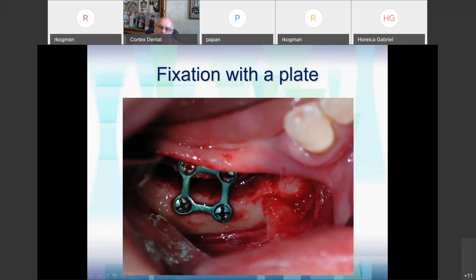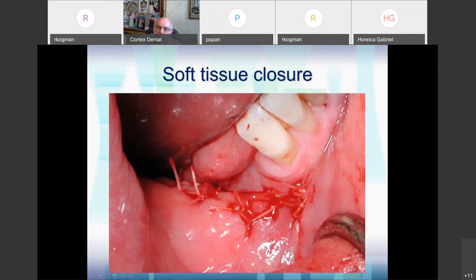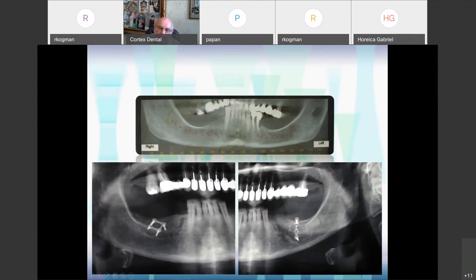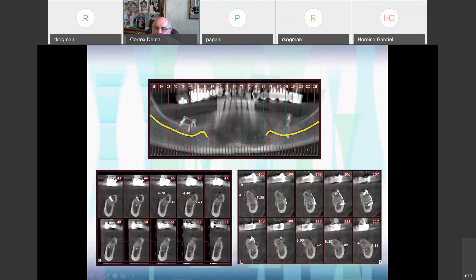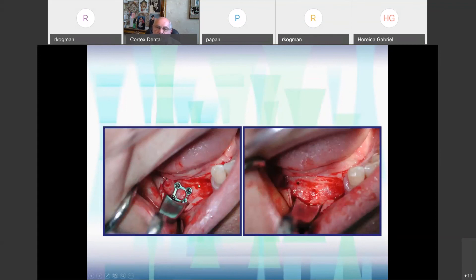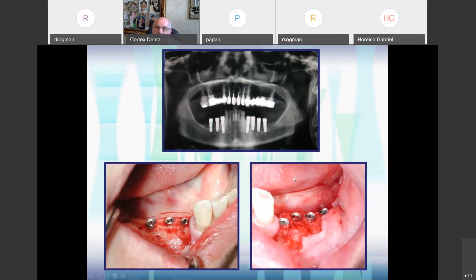I used a square plate and filled up with bone here, bolted it up. You can see here the left side — the left side was done by my deputy Dr. Sami Poo, who tried the technique on this side using one plate. This is the end result — look at the nice bone that we got. When we opened, you can see very nice bone, looks like original, and inserted implants.